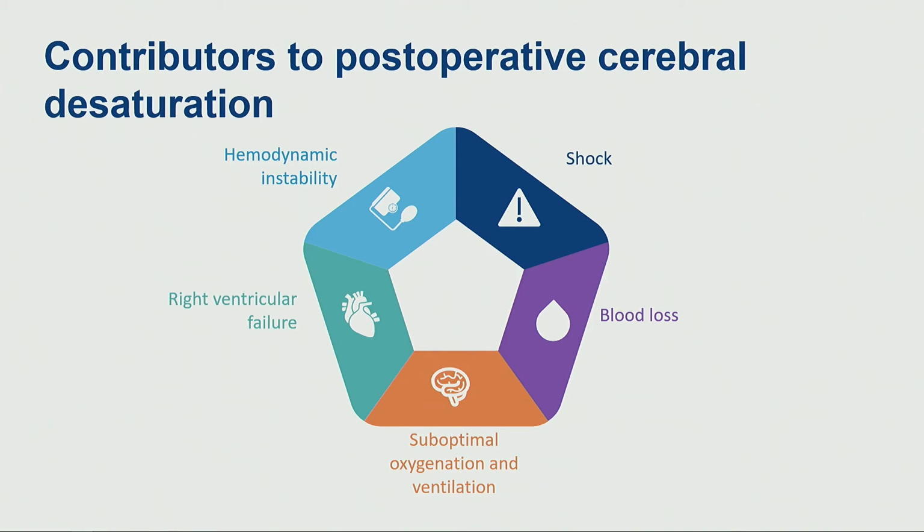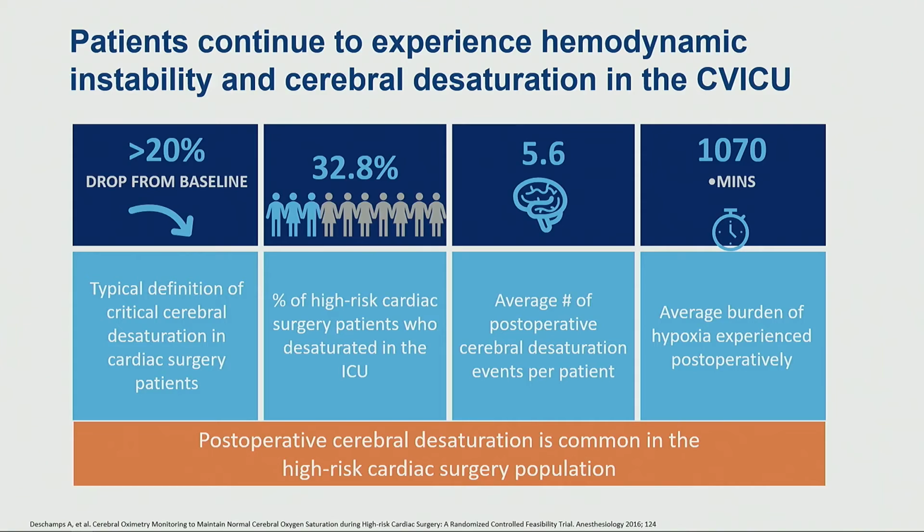How do all of these fit in? Now, the studies I'm going to show will tell you that up to 30 to 40% of our cardiac surgical patients do have cerebral desaturation. Patients who do have cerebral desaturation, furthermore, have lots and lots of events and lots of cumulative time spent under a cerebral desaturation threshold. The next obvious question is, does it matter clinically?